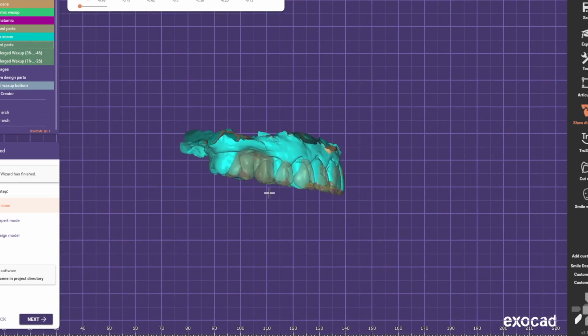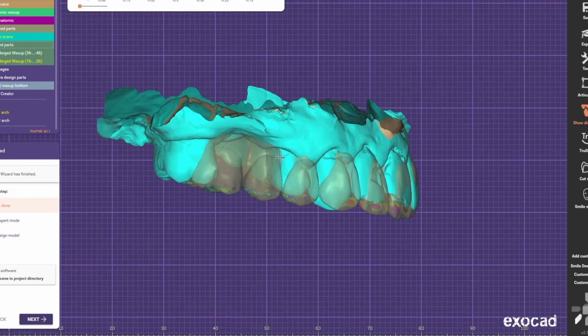And he's like, are we gonna have enough room to restore the case if we keep those implants? And fortunately, when the implants were placed, probably no grafting was done. So he's already had some ridge resorption. So the implants are far enough apical that we don't have to remove them. We don't have to plan for like an FP1 style of case. We can actually do more of an FP3 hybrid design.